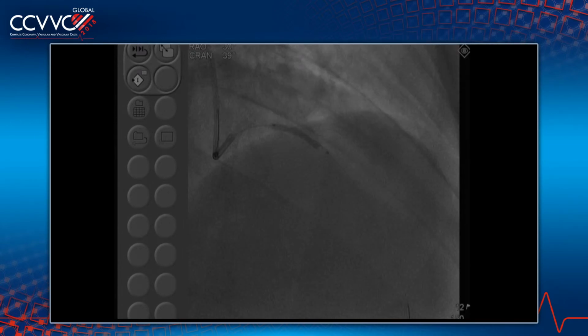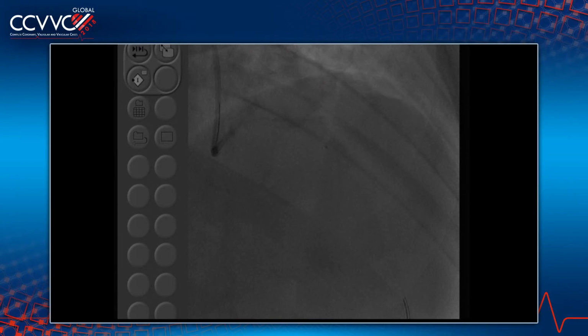Take out now the LAD balloon, recross, and this is a key: when you recross and dilate the stent, it has to be a non-compliant balloon. Leave this strut, let's leave this one. Show us what you're doing with it. We'd like to see your wire. Which wire are you using to recross? Don't lose the wire in the LAD.